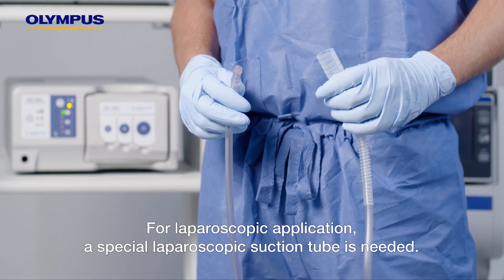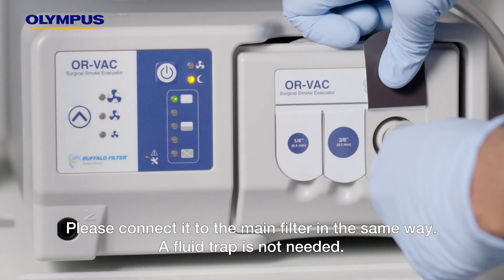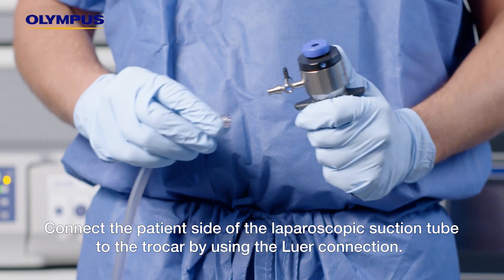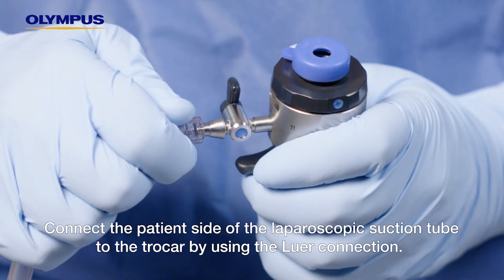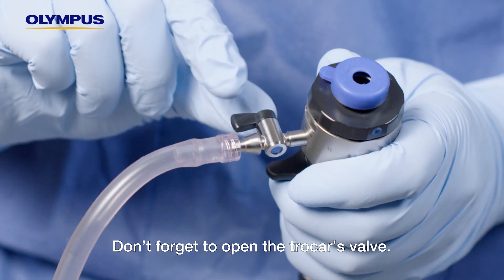For laparoscopic application, a special laparoscopic suction tube is needed. Please connect it to the main filter in the same way. A fluid trap is not needed. Connect the patient side of the laparoscopic suction tube to the trocar by using the luer connection. Don't forget to open the trocar's valve.